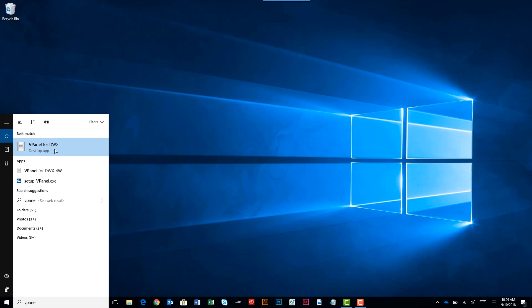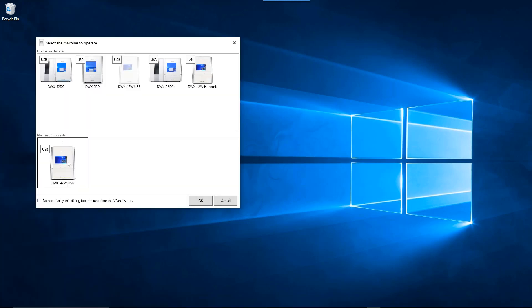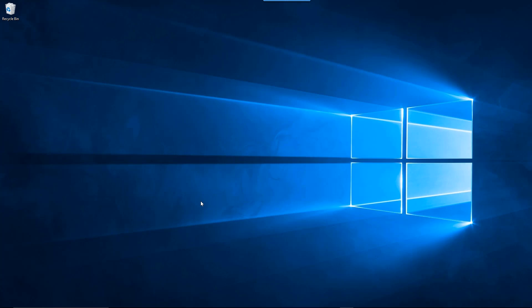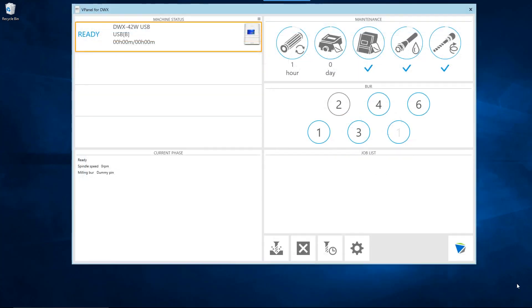Open the panel on your computer. When the machine selection screen appears, select the DWX42W and click the OK button. Once the vPanel home screen appears, click on the Replace Coolant button.